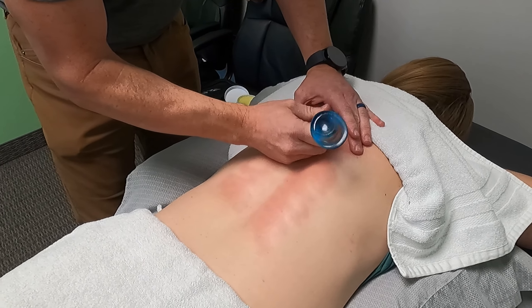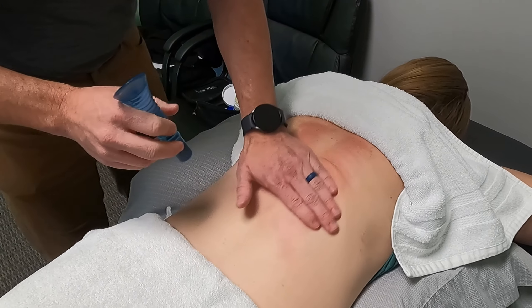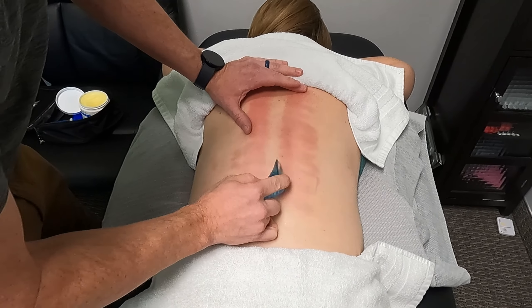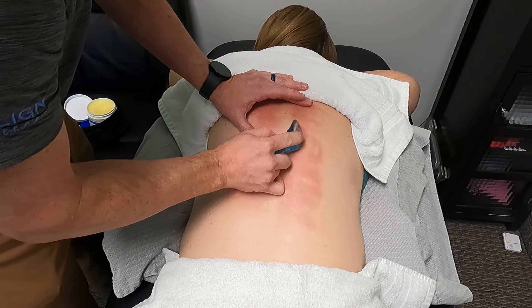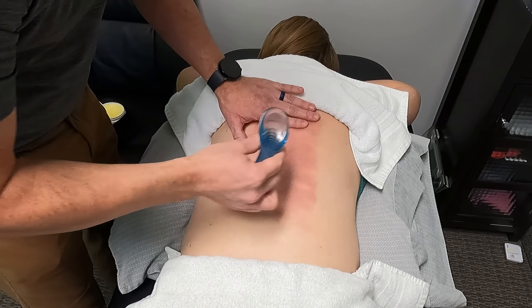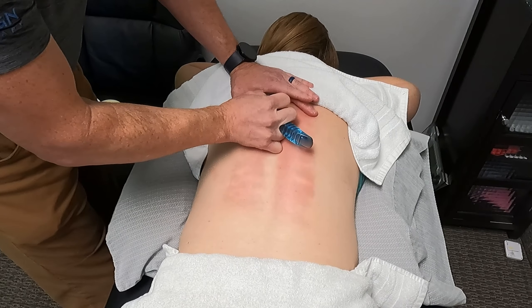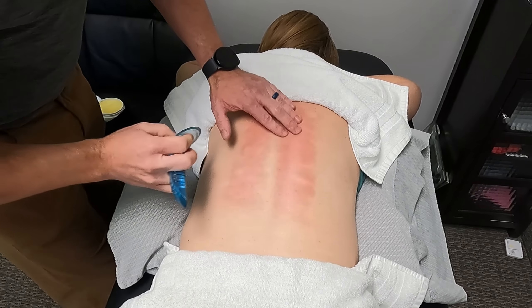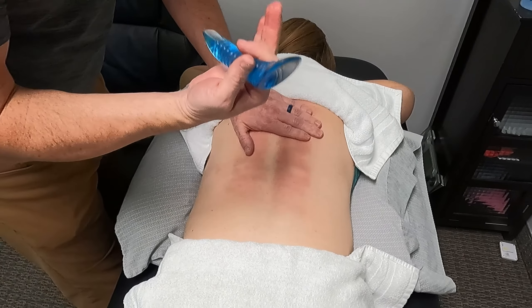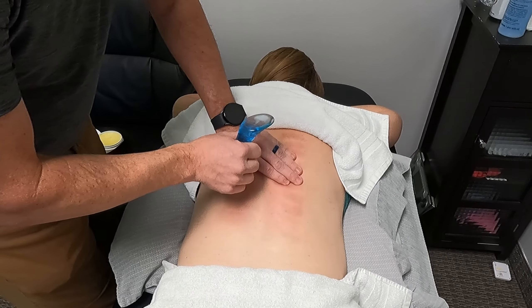I don't usually push towards the spine because it compresses the tissue between the spinous process and the tool. We'll go through and try to really get some good blood flow in there. With the scoliosis, as I go on the right side, I feel more tissue because again, it's back towards me more on that right side. On the left side, I don't feel quite as much. Don't make the mistake of thinking there's just more tissue to work through — remember the ribs are back further, which makes it feel like there's more there.